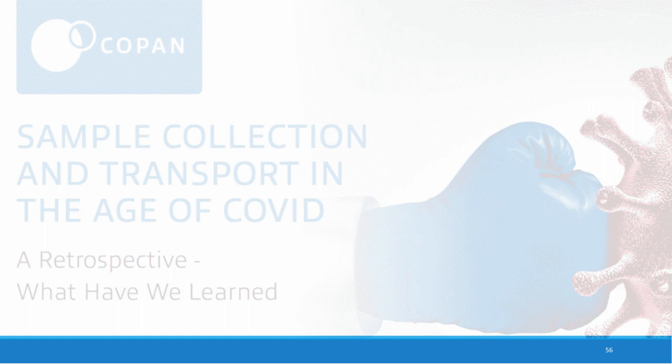Certainly for home collections, if they're sent in to a laboratory, a CLIA laboratory for molecular testing, of course, there's the human gene that is assayed for in many of those molecular collections, and if the human gene is not detected, then the assay is not able to be read. So that's one way that you can assure that there has been specimen added to the swab. For antigen tests, rapid antigen tests, or other antigen tests, that is not available. So in those particular cases, there's really no way of determining adequacy of the sample.